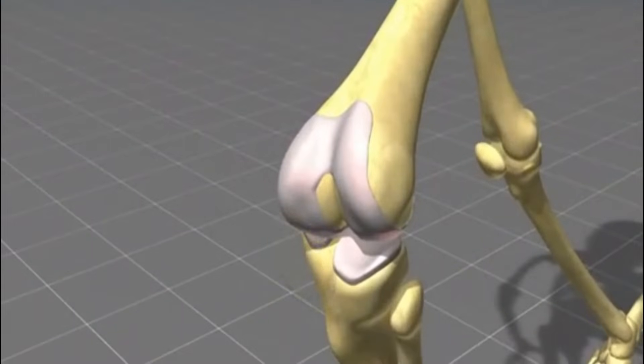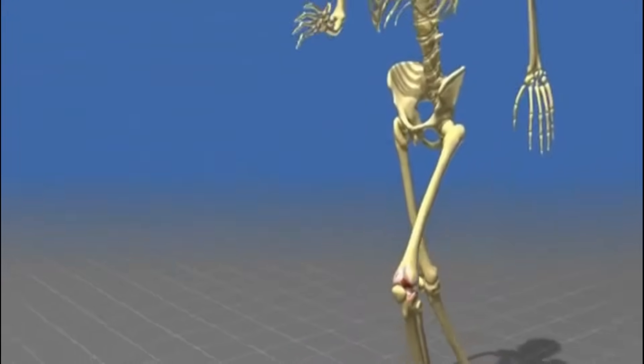The most important structure of the knee joint is its cartilage surface. Due to trauma, overload, and genetic disorders, the cartilage surface might be damaged.